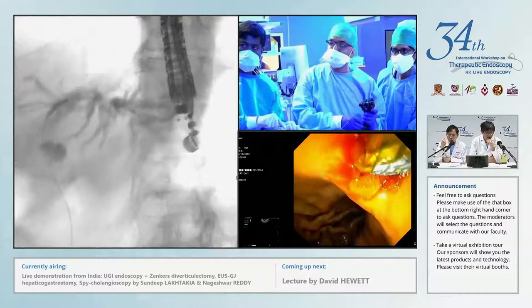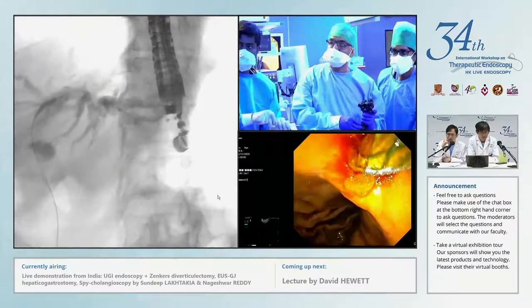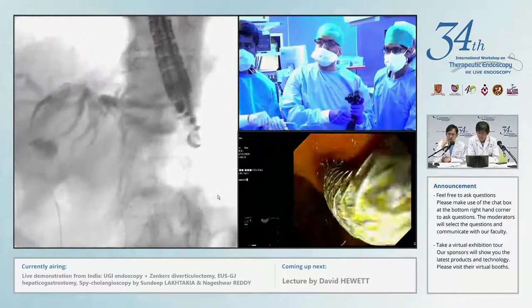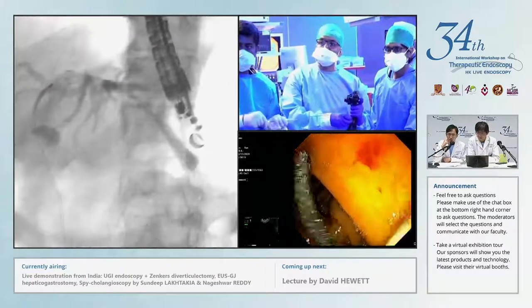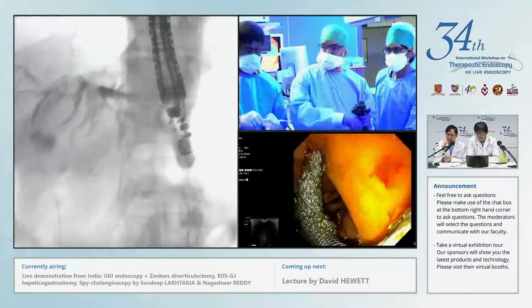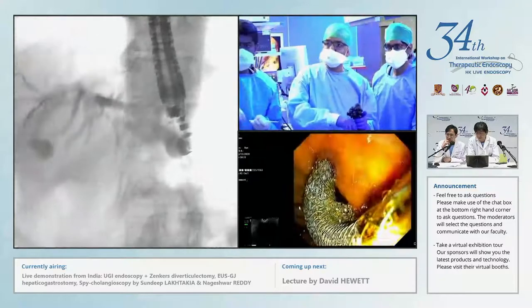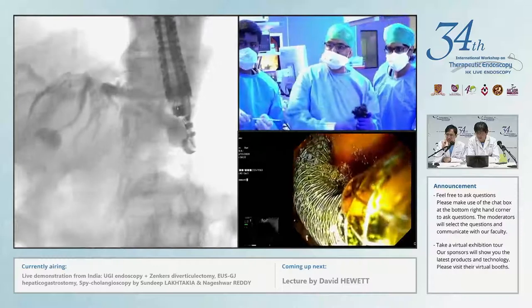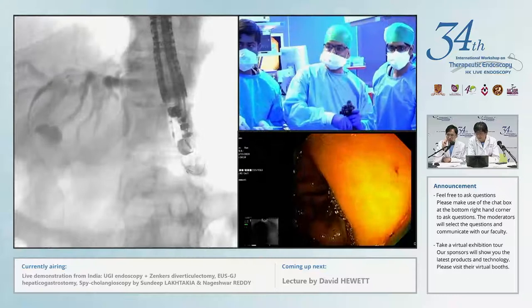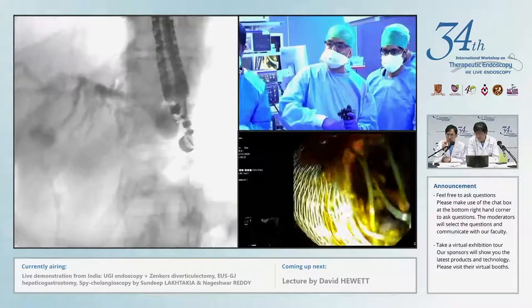Release. So part of the stent will be in the channel. Yes, that's okay. It's a long segment, but this will shorten very soon. Yes, that's it. Beautiful. Pull the wire. Check it. Stent now open. Pull my wire. Yeah, that's fine. Pull. Okay, my position is fine and that's why I'm pulling back the wire now.